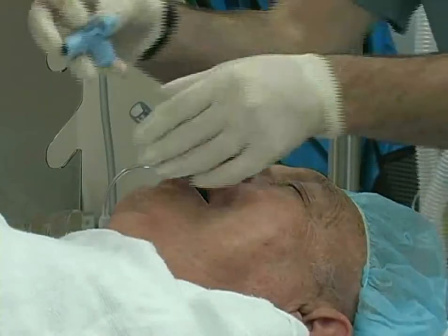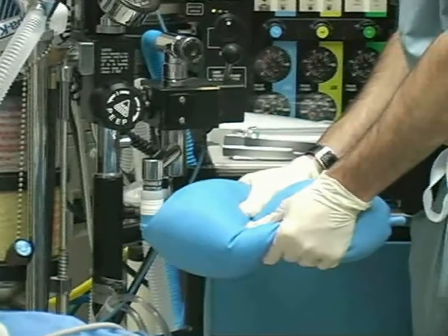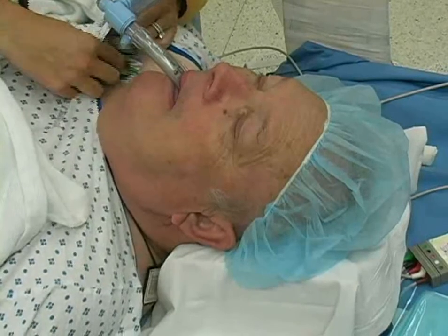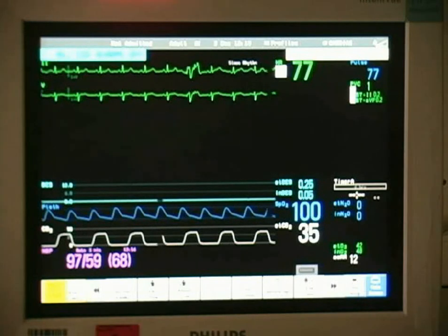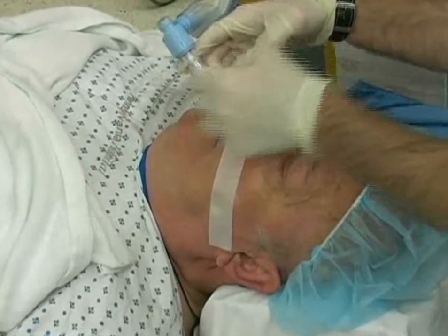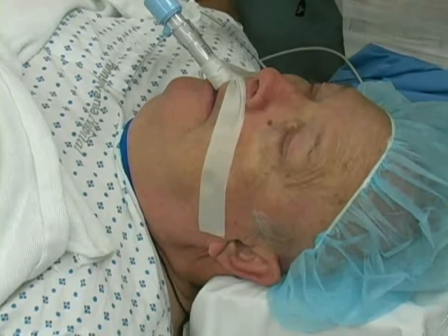After successful LMA insertion, connect the laryngeal mask airway to the breathing circuit. Provide a gentle breath with the reservoir bag, not to exceed 20 centimeters of water pressure. Confirm successful ventilation by watching for chest rise and auscultating the lungs bilaterally. Verify ventilation by checking the monitor for the presence of end tidal carbon dioxide. After confirming effective ventilation, secure the LMA in place with tape. The tape is fixed across the patient's cheek and upper lip, wound around the LMA tube, and again fastened to the upper lip and opposite cheek.